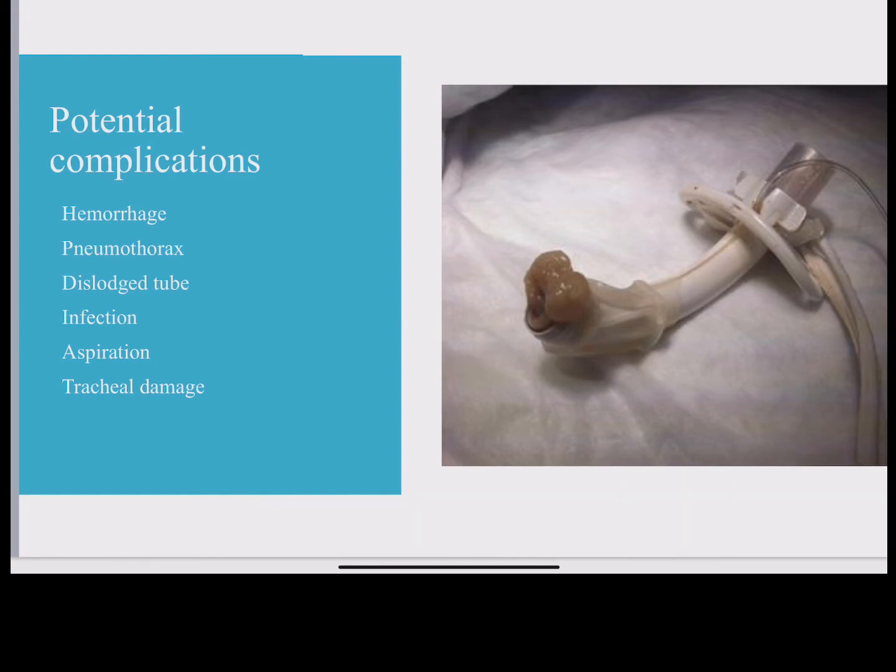If the entire trach decides to come out, you have two choices. Put the trach tube back in, or number two, you're going to wait and see how they do. Sometimes when it is a chronic trach, it's nice and open. The patient has time to grab the supplies to replace it, and they can breathe okay-ish.